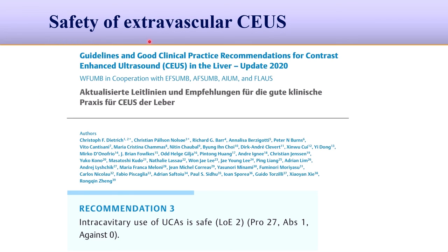Safety of extravascular contrast enhanced ultrasound. In the new WFUMB guidelines of contrast enhanced ultrasound in the liver, it says that intracavitary use of contrast agents is safe.